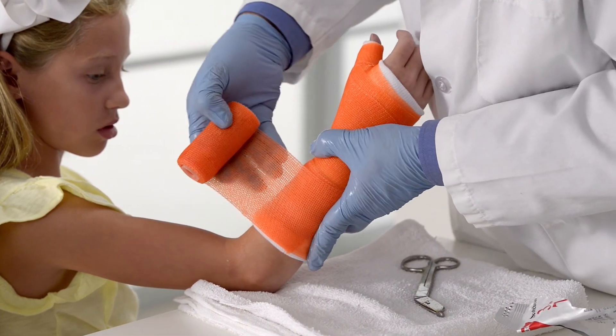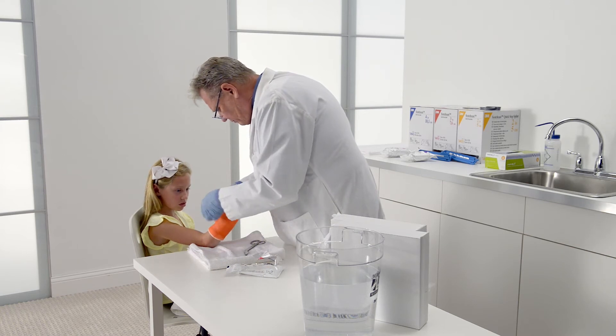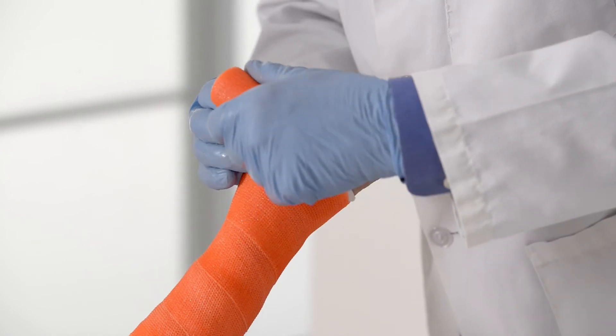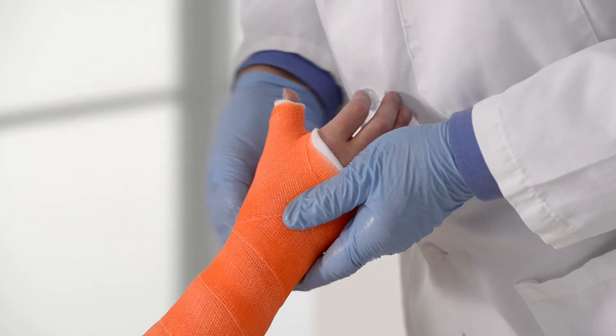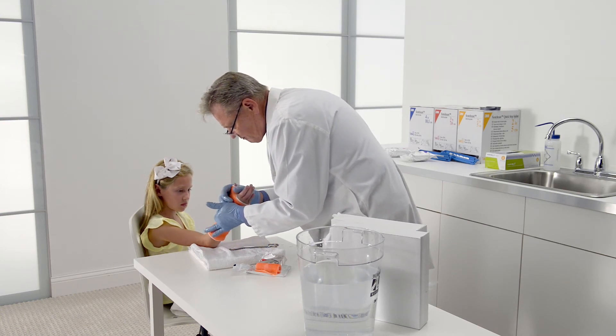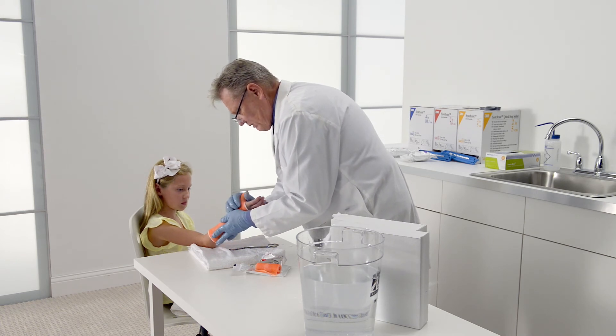Then roll the casting tape over the first layer of casting tape, starting near the elbow with 2 wraps, then wrapping down the arm and once more around the thumb and palm. This technique results in a smooth, well-laminated cast. Rub the cast by keeping palms flat to avoid the creation of pressure points that can lead to soft tissue complications.